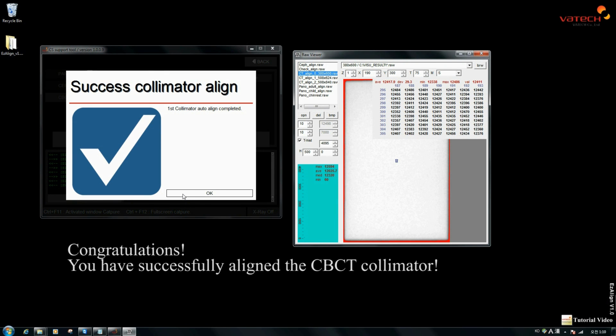At the end of your CBCT collimator alignment, you will then be prompted for a successful collimator alignment.